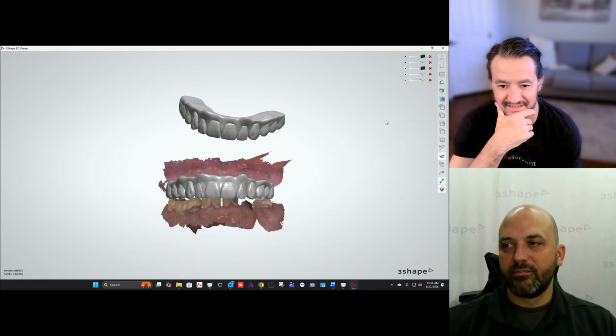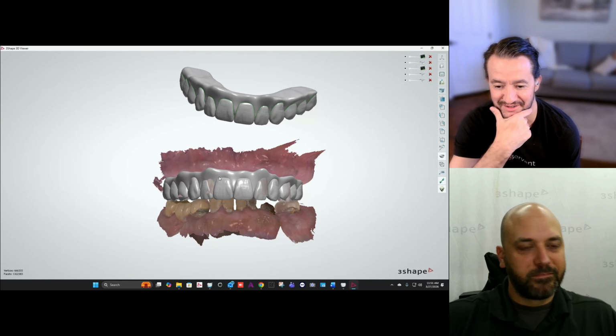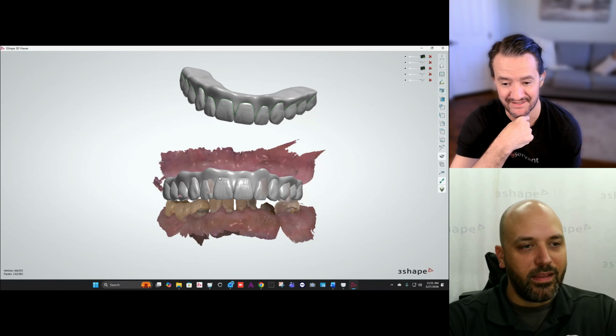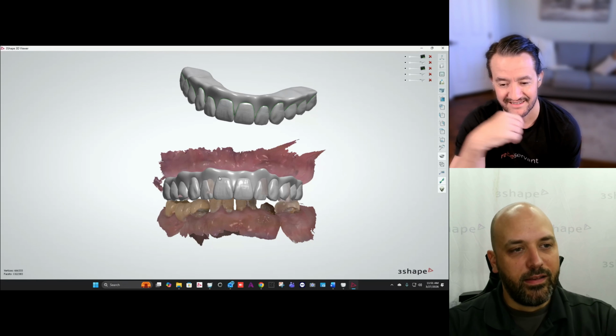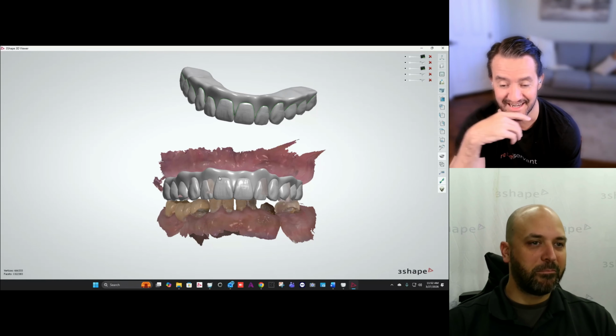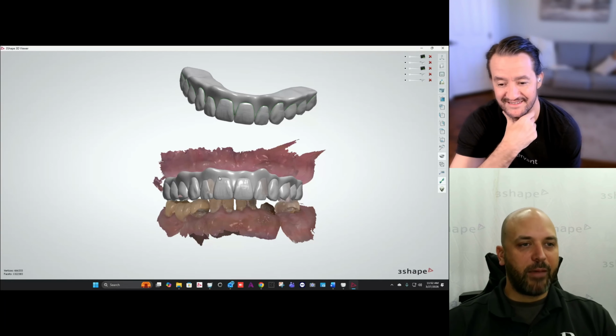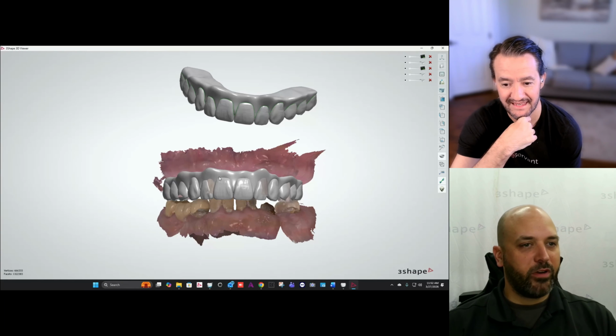Well, Brandon, my guess is this wasn't something you learned in 5 minutes. It's probably something you learned over time, troubleshooting and doctors sending you scan after scan, just figuring out how to make a scan valuable in your workflow and what you need. This is super cool, and you can use this for a lot of different things.